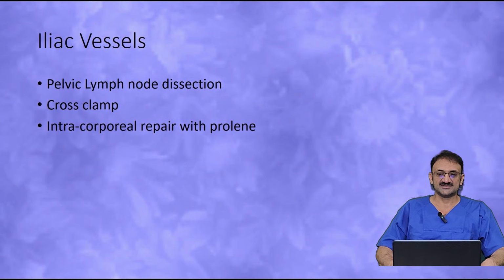So the iliac vessels, like common iliac vessels or the external iliac vessels, get injured while doing the pelvic lymph node dissection, or doing, for that matter, ureteric reimplantation, or for that matter, performing orchidectomy for an undescended testis.